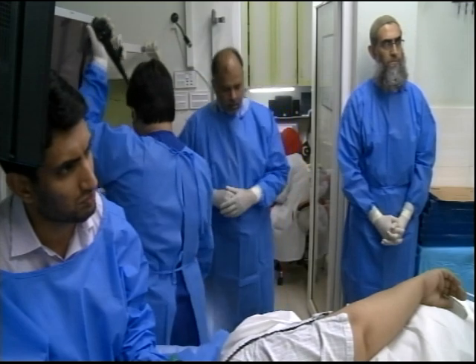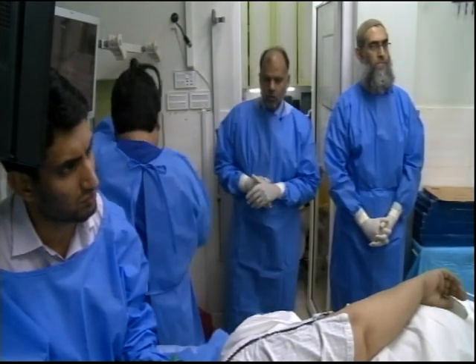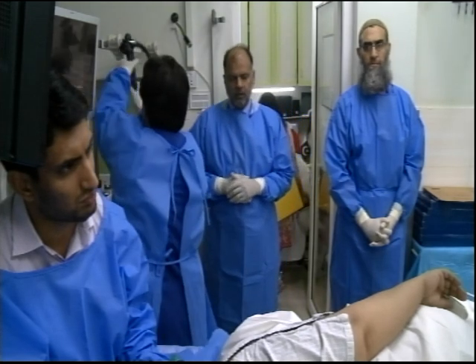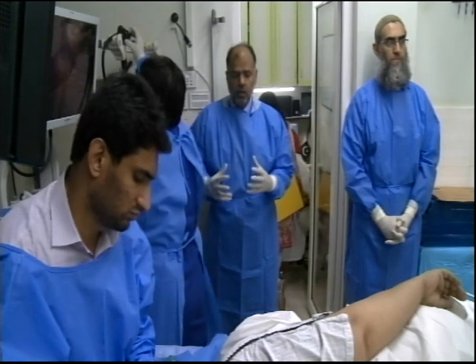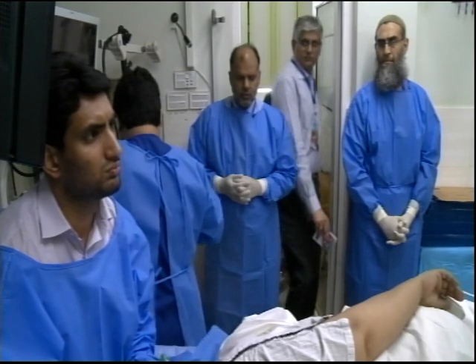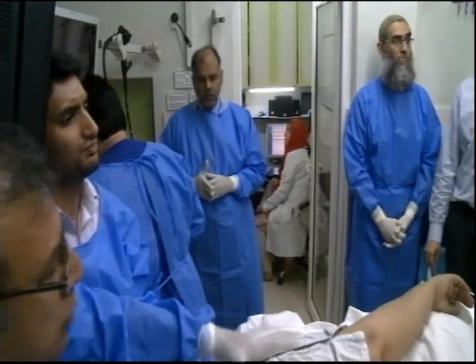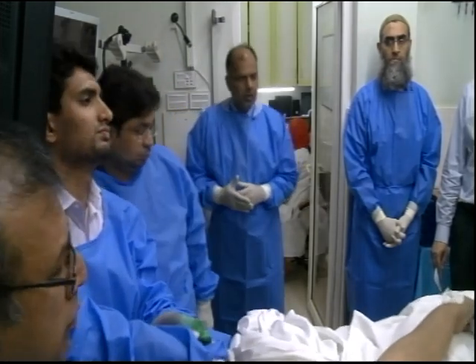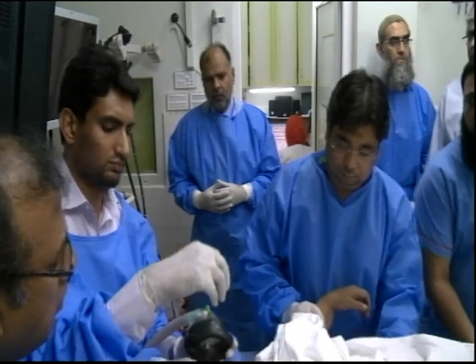So what do you think is the first thing you should be looking for in a submucosal lesion before we go on to these characteristics, that is, is it arising from the wall or not? So you have to decide if this is actually an external impression of a viscera, like a spleen or any other, a lymphadenopathy or anything else.